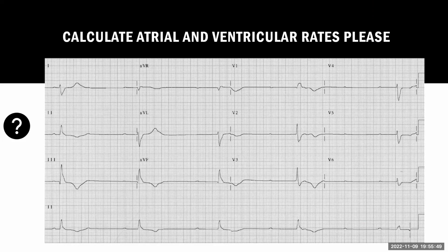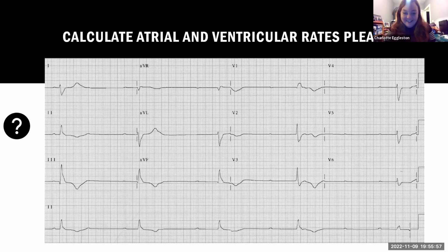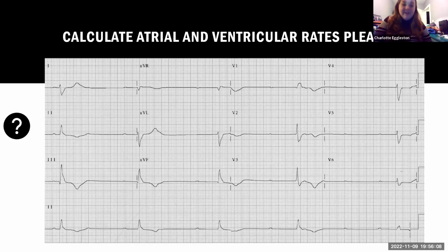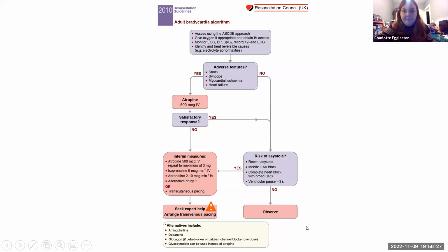Is it 4 QRS at the lead 2, so times 6 is 24? Yeah, worryingly low. And then what about your P waves for the atrial rate? 33. Yeah, something like that. So I haven't worked out the specific bit. It's about 300 divided by about 11-ish, looking at the P waves down here. If you wanted to do the atrial rate the same way you just did the ventricular with the times 6, it can be more difficult because P waves often get swallowed up in the QRS. So I would often use the 300 rate for that, but no, that's right on both counts.